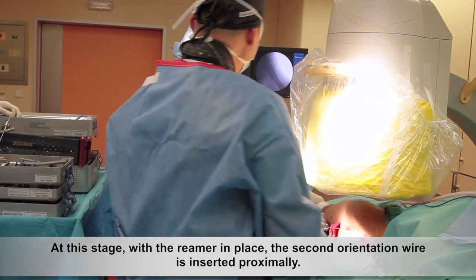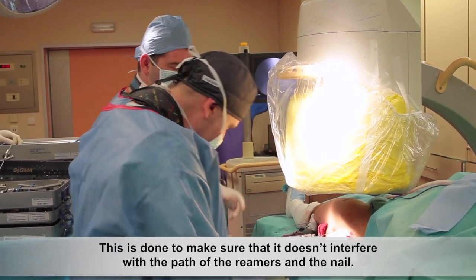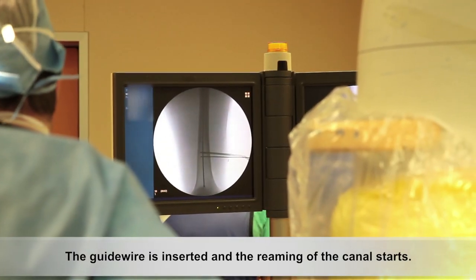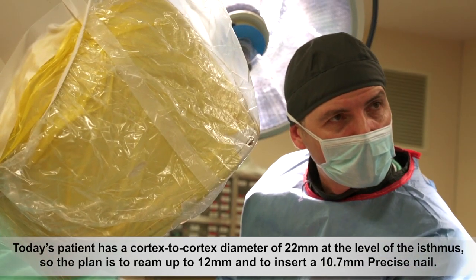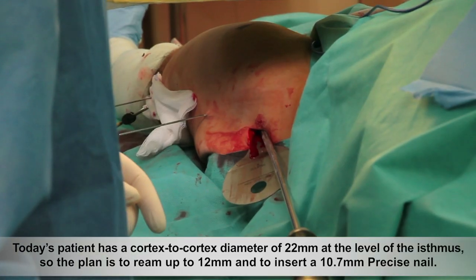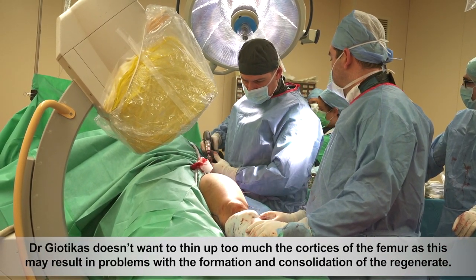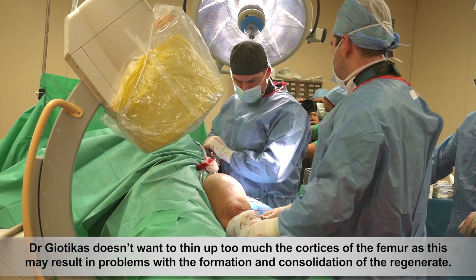At this stage, with the reamer in place, the second orientation wire is inserted proximally. This is done to make sure that it doesn't interfere with the path of the reamers and the nail. The guide wire is inserted and the reaming of the canal starts. Today's patient has a cortex-to-cortex diameter of 22 mm at the level of the isthmus, so the plan is to ream up to 12 mm and to insert a 10.7 mm Precice nail. Dr. Giotikas doesn't want to thin out too much of the cortices of the femur, as this may result in problems with the formation and consolidation of the regenerate.